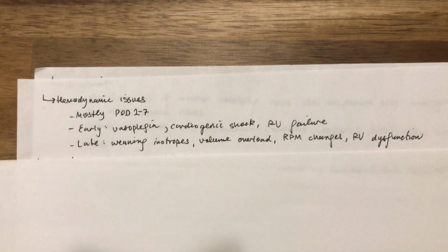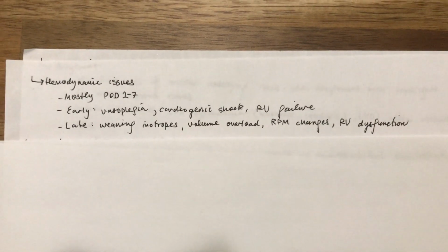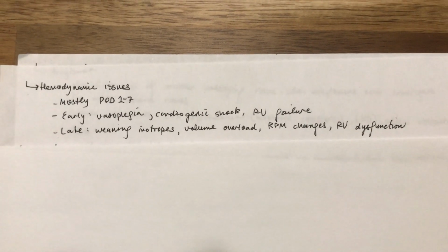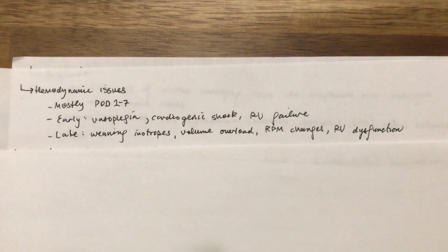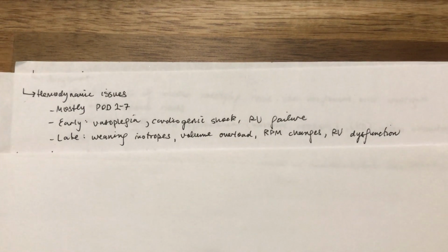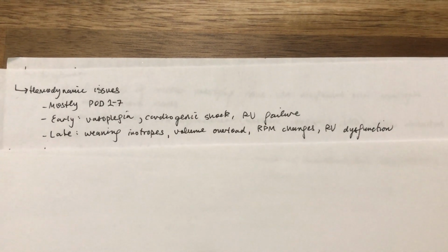So we'll first talk about hemodynamic issues, and I kind of lump these together in that the first post-op week, there's going to be a lot of adjustments in the patient's physiology to the new VAD, and that's totally okay. I just put this first in that whenever you see things happen, you always have to ask yourself, is it just the patient adjusting to the VAD and the VAD adjusting to the patient?